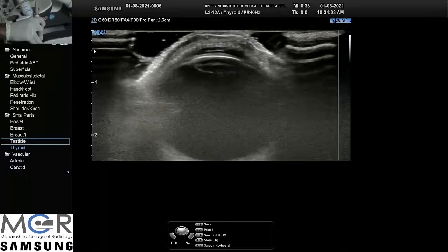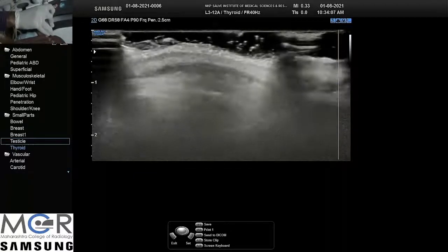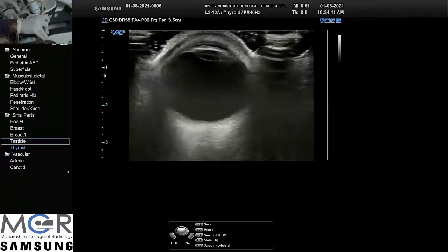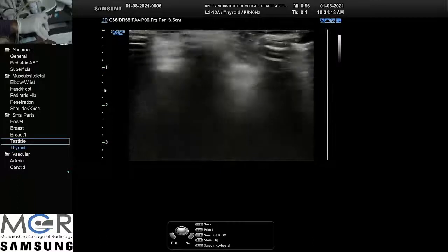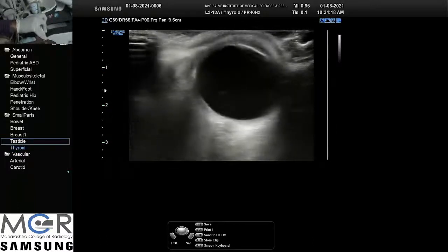So you can see that cataract there, dense cataract, and probably they are not able to see the posterior chamber. So we will give them information whether they can go ahead with removal of this cataract.